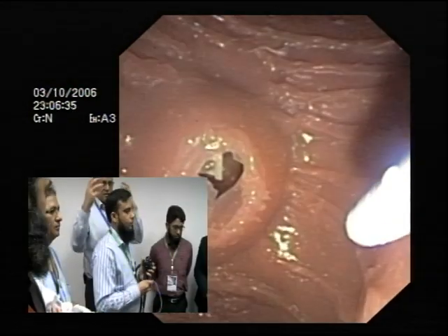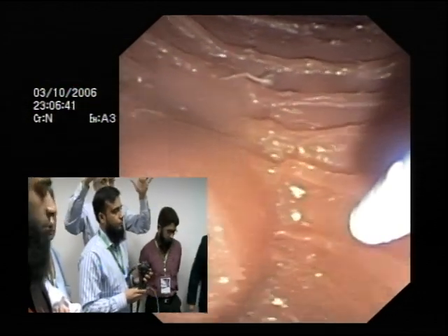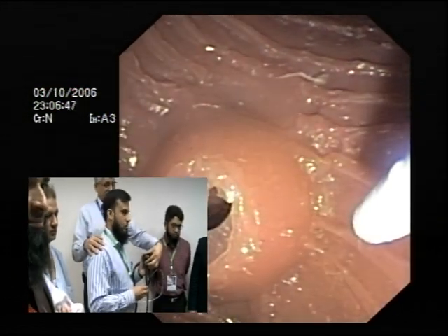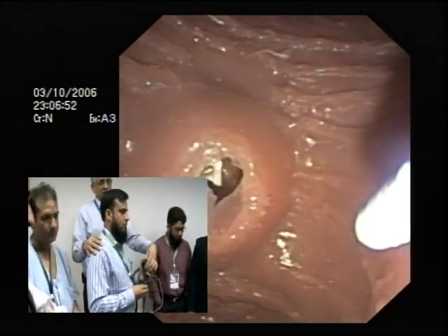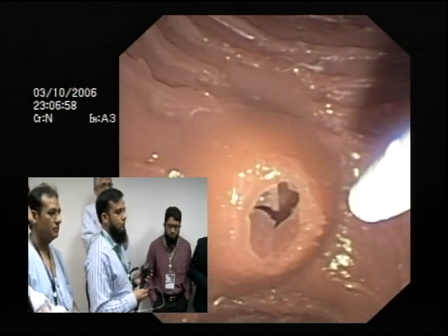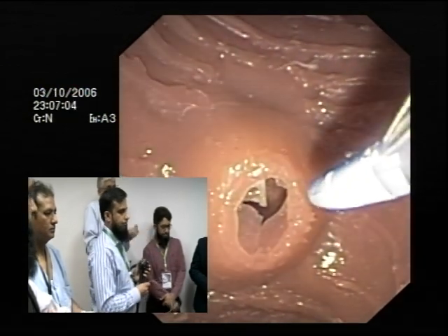And these things you start understanding like you drive the car, then you don't have to think. You know, idhar hai mujhe ye karna hai, idhar chala gaya mujhe ye karna hai. Theek hai, agar main ye karunga to it will come back. Right is going towards this, left is coming, bringing it here. And I think once you start understanding those movements, then at least your position, position of your ampulla is achieved and maintained. Okay. Because there's no point achieving that and not maintaining it.